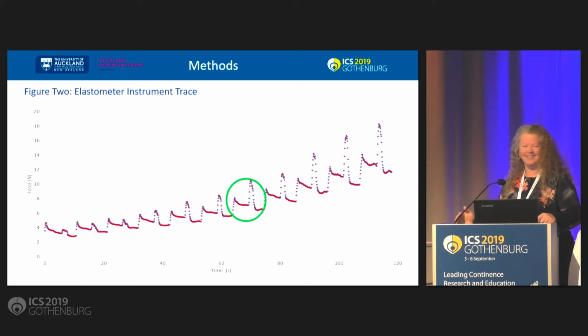Because are you measuring the active components or also the passive components, or the combined components? It's the force, it's the displacement. Sorry, I'm having a complete mind blank over your question. But it's when you perturb the muscle or you move the muscle, it's that force response with the displacement, force to displacement response, and then we're plotting it and we're measuring it from the slope of that curve.